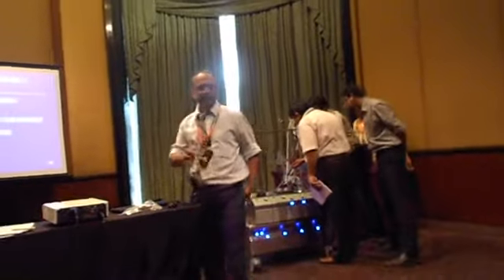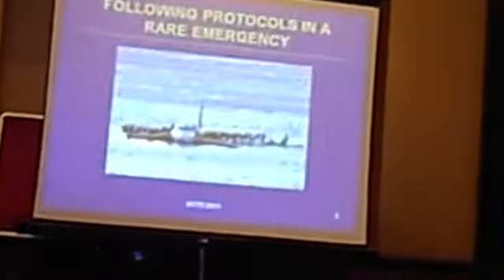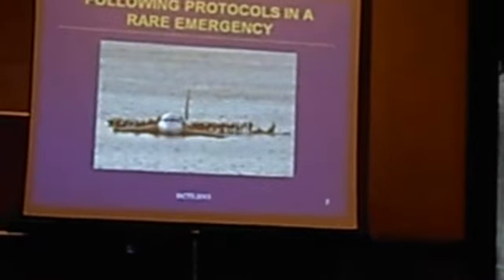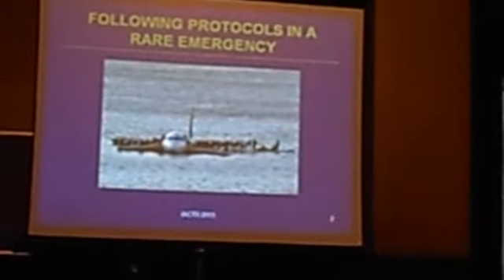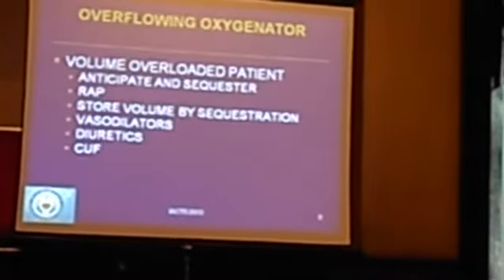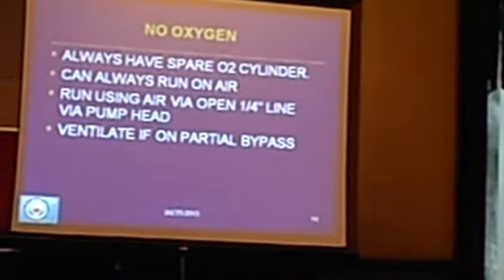Into your membrane. Where is the other end going? That is going towards the surgeon. Robotic surgery is also using this. So again I told you, to land, you have to practice. If you don't practice this, you would never be able to do it. Failure of oxygen. So you take it out. So no oxygen, always have a spare oxygen cylinder.